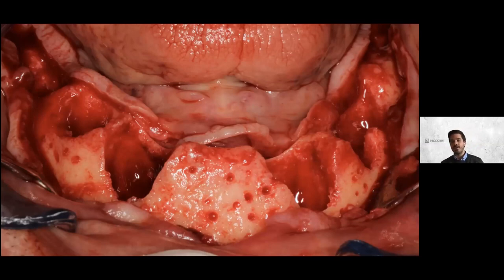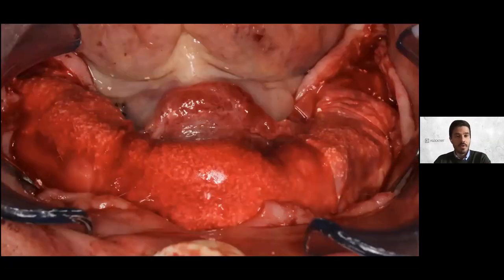I did present the randomized clinical trial defending the cortical perforations. And this randomized clinical trial said that if we perform the cortical perforations, we will have a higher increase of new vessels and also new osteons around our regeneration, compared to if we don't perform this kind of cortical perforation. So the cortical perforations are crucial in guided bone regeneration. So after that, we go for this technique.